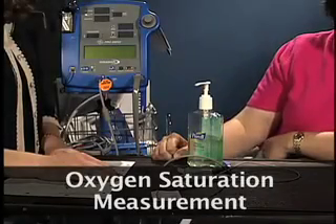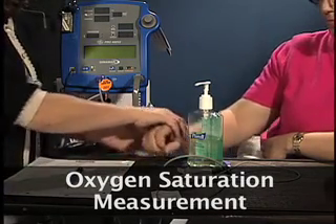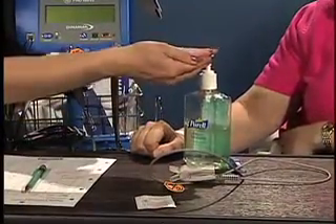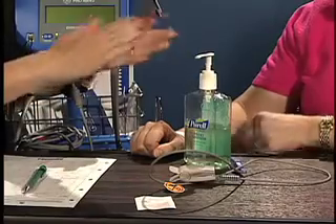For every procedure you perform, you should identify the client, gather your equipment, perform hand hygiene, and explain the procedure to your client.